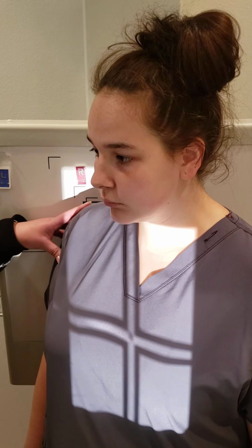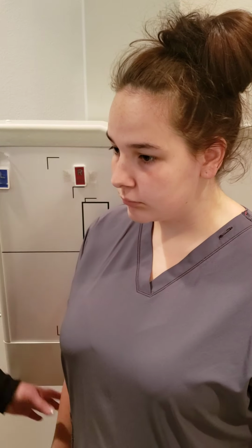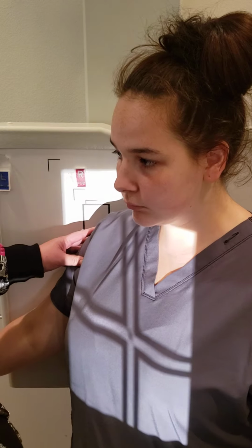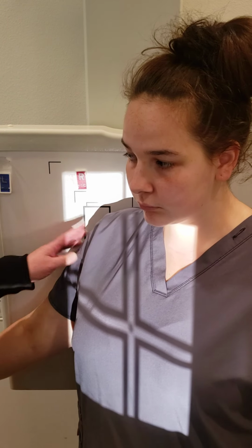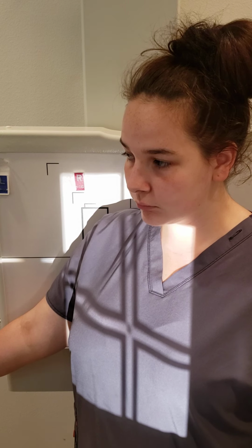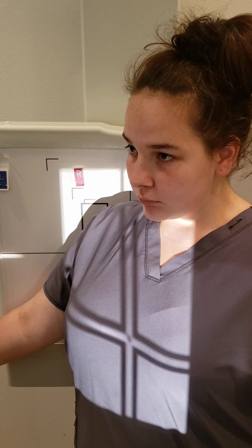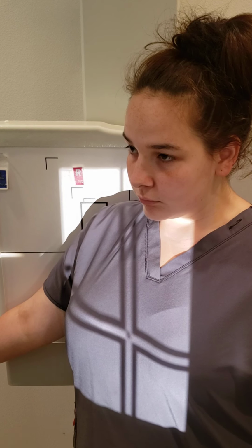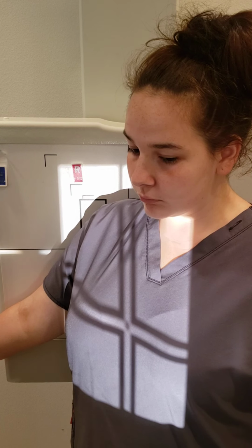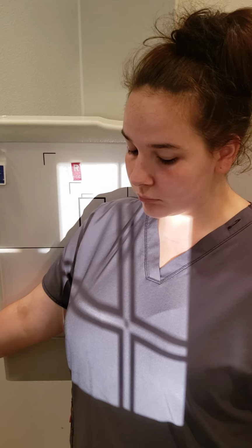We're going to have you step back. There you go. Right about here. Just going to have you bring your arm out a little bit. And that is our 45 degrees. So take another deep breath in, hold your breath, expose, so you can breathe. So what this does is visualize the right posterior side. We're going to take a look at anterior ribs here.